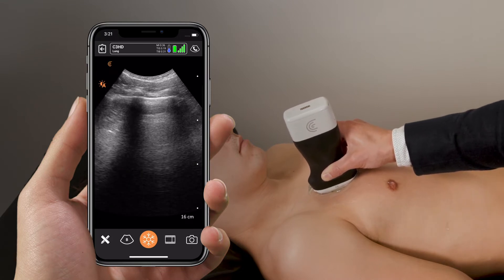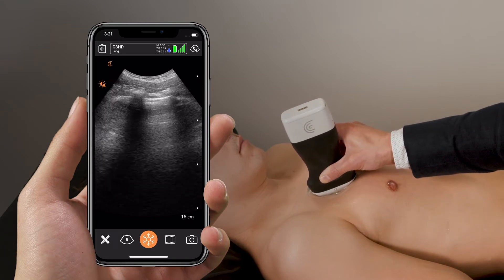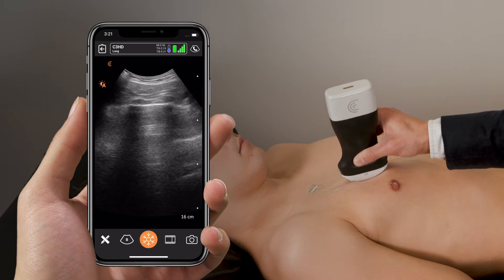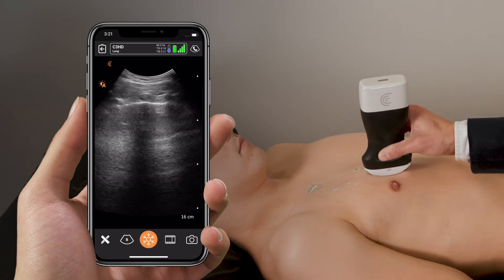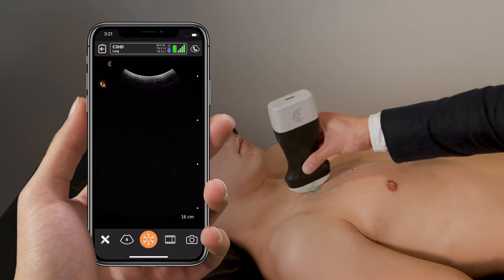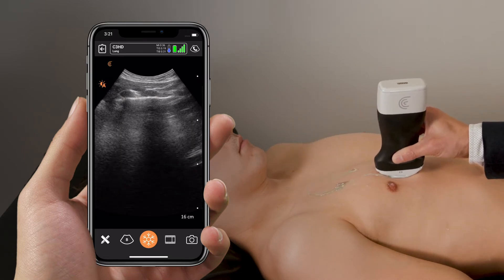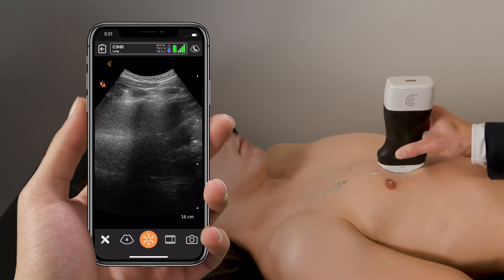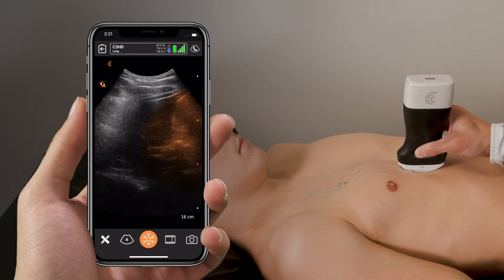We'll start here in the upper lung zone on the anterior aspect of the chest and scan downwards, visualizing one interspace after another, slowly moving down towards the lower field of the anterior lung until we get down to the liver.